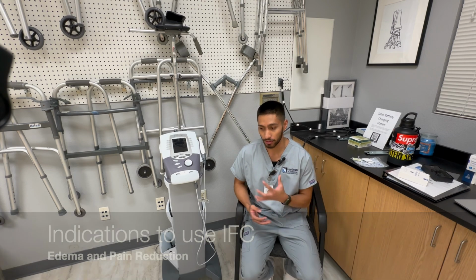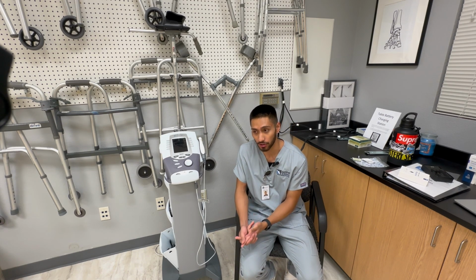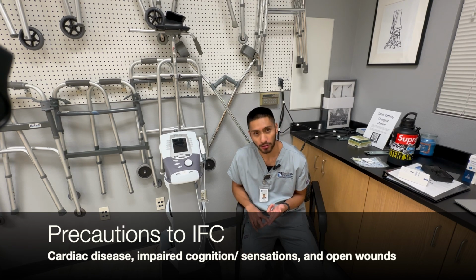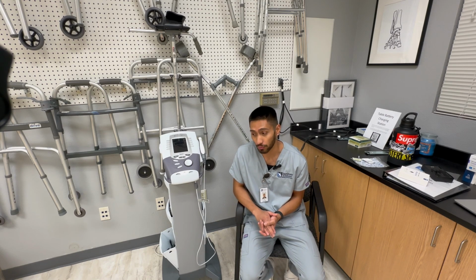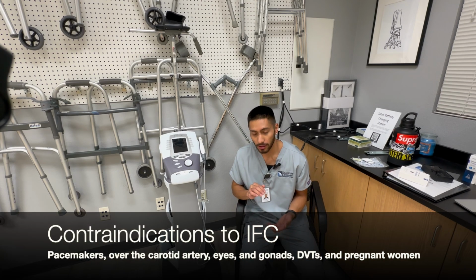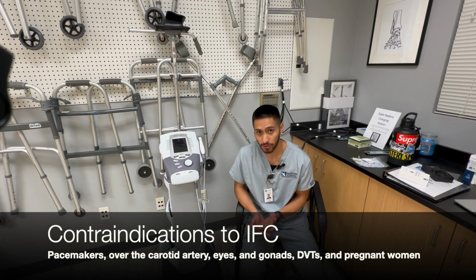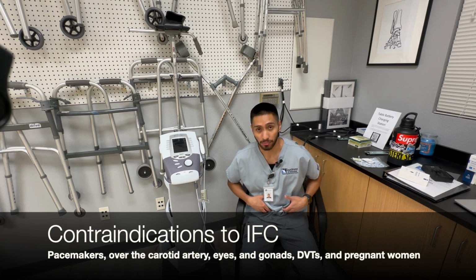Today we're going to be using it for pain reduction because I have some shoulder pain going on. In addition, we're also going to be talking about precautions and contraindications. Precautions would be cancer, any cardiac disease, impaired cognition and sensation, and any open areas for wound care situations. However, there are contraindications where we would not use it, such as if a patient has a pacemaker. We do not want to place it over the carotid artery, over their eyes, or over their gonads. If they have deep vein thrombosis, and in addition, if they are a woman, we do not want to place it on them if they are pregnant, specifically in the lower abdomen region.